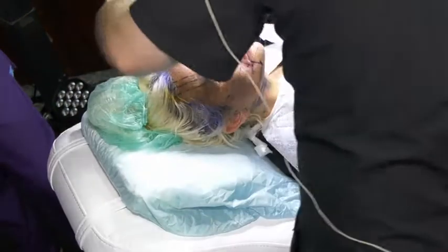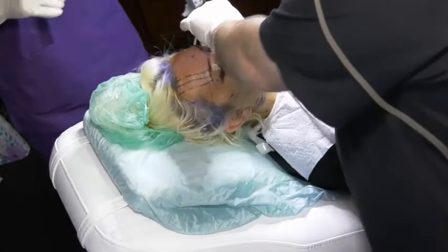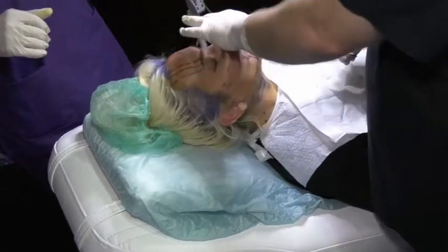Okay. We finish this case for the face. Can you give me a scissor? I want to cut and see what did we do. When you cut, it's very important that you hold, press and cut. Hold.